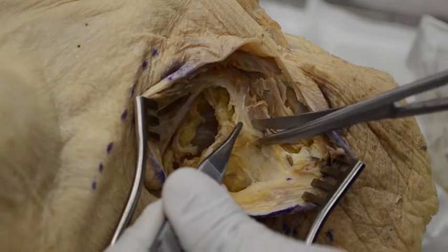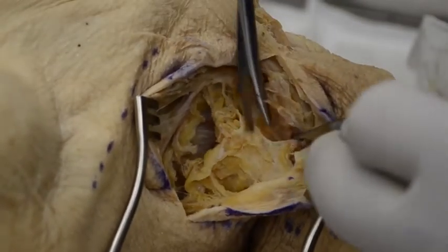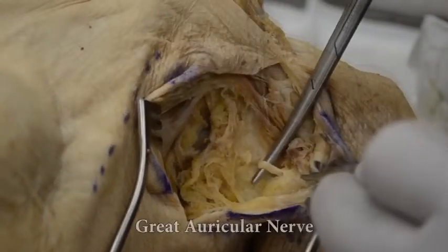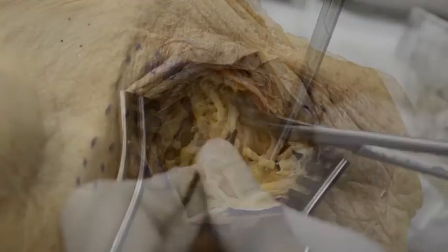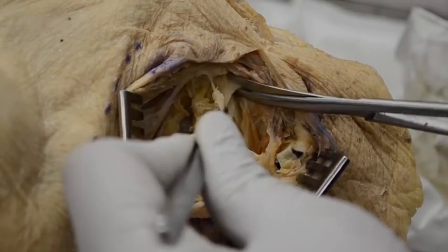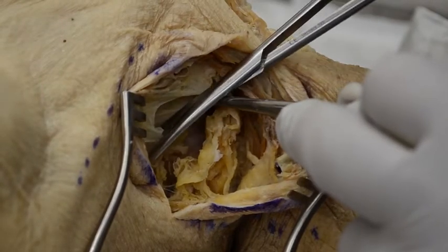Along the posterior border of the sternocleidomastoid we can see the great auricular nerve winding around the muscle. This should be preserved to maintain sensation of the ear lobule. More cranially, about a centimeter and a half away, we can find the spinal accessory nerve if needed.